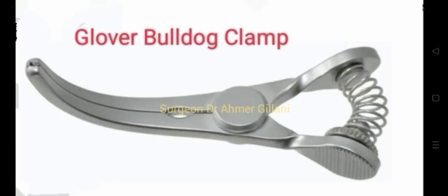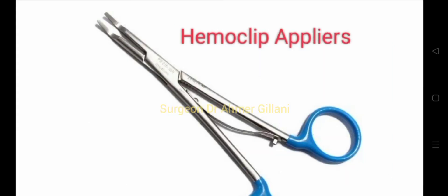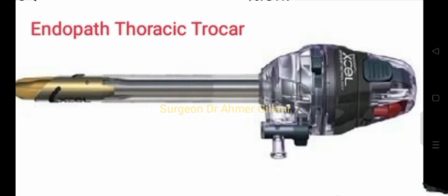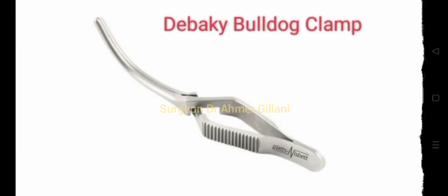The very first instrument is the Glover bulldog clamp, then you have the hemoclip appliers, and then the Dietrich bulldog clamp. Next is the Endopath thoracic trocar, then you have the Wurst tubing occluding clamp, and then the DeBakey bulldog clamp.